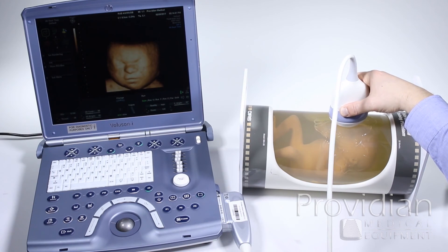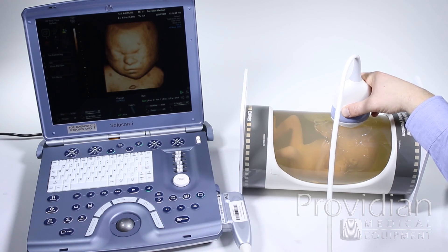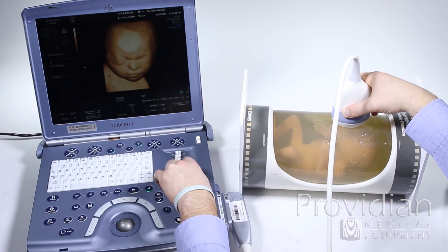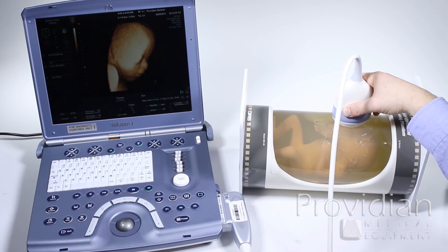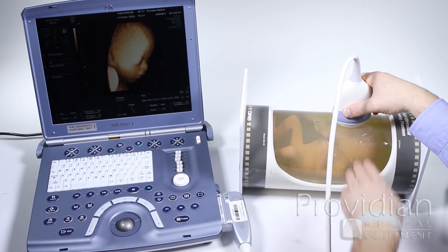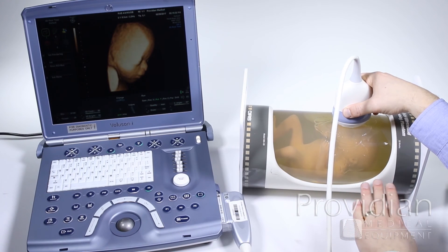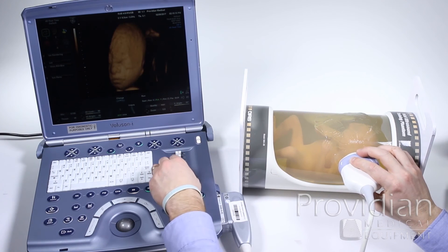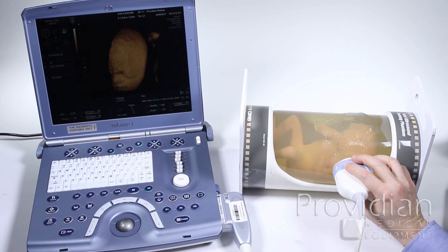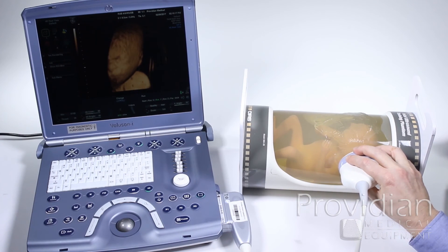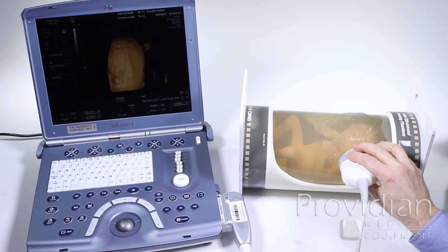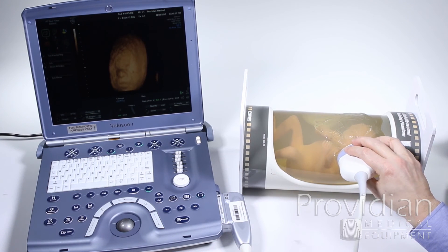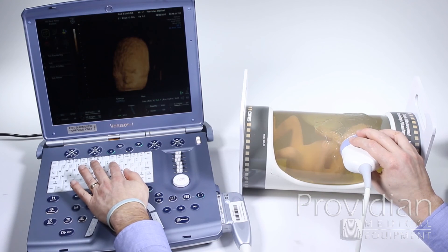You're going to have a huge advantage over others if you can do this well. A lot of people rely on the XYZ controls to try and make the image better, but if I change this — even though the probe is looking down and rendering here — I'm asking it to look at something over here, and your image quality is going to be way lower than if you just move the probe. You can see how poor the image is now — I changed the Y rotation so I'm asking it to look at the face when my image is of the ear, and that face looks distorted. The depth isn't right.